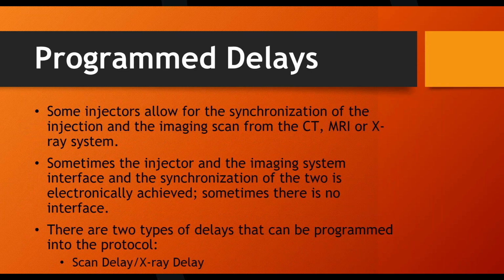Delays. There's two kinds of delays, but they go by 3 different names. So we have an imaging system and we have the injector system, right? And they work together. They have to be used in tandem with each other.